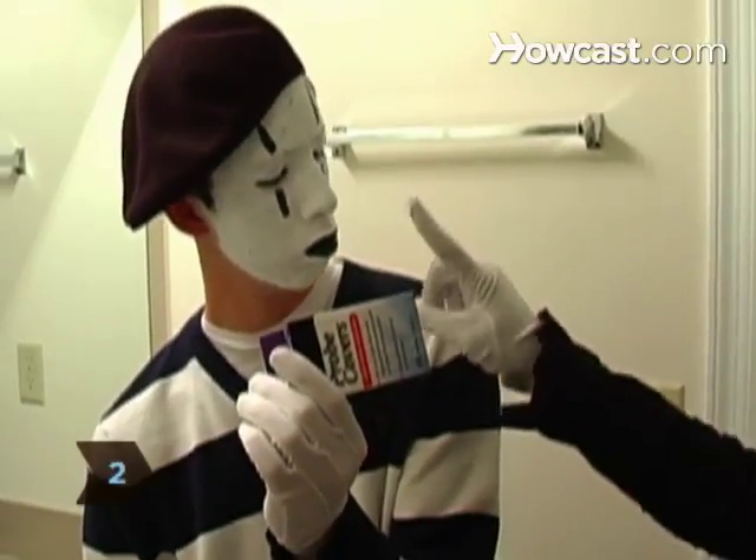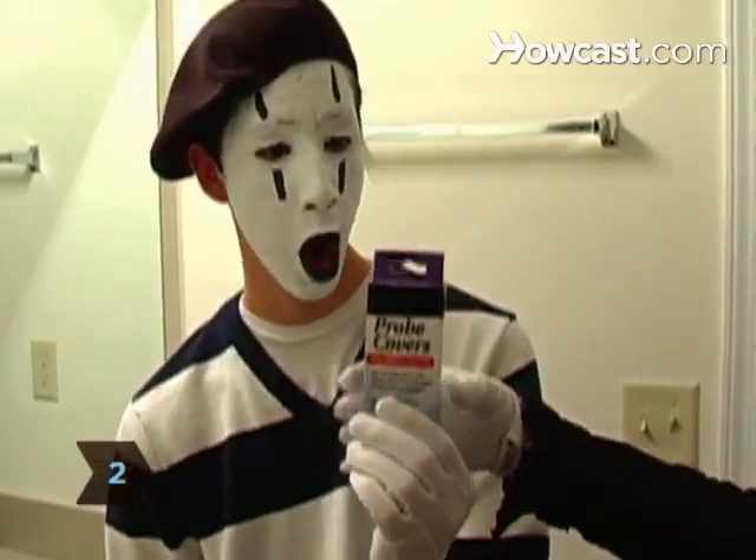Step 2. Read the directions that come with the thermometer and understand how to use it.